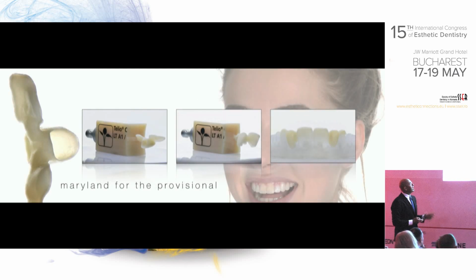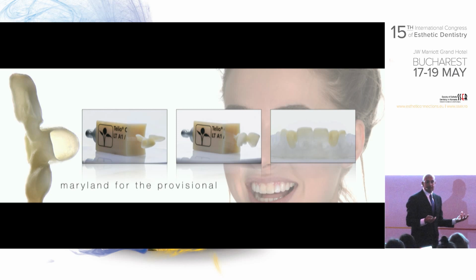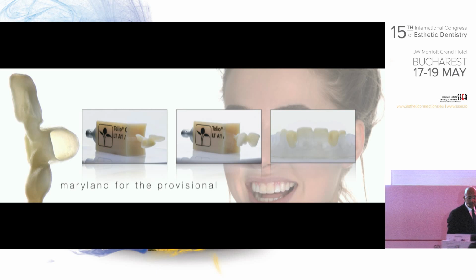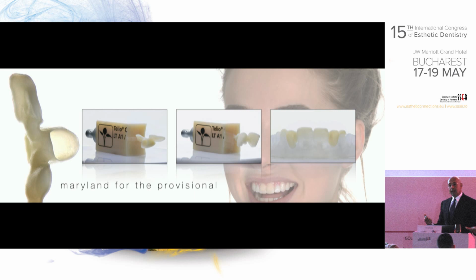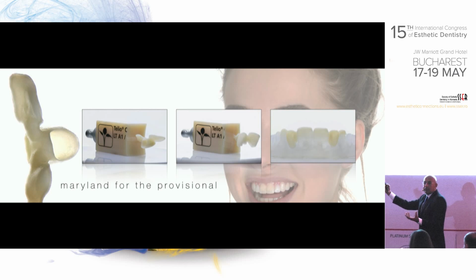So at this stage, Hilal came out with this idea of making something different, which can be worked with in two different ways. This is a provisional, sort of a Maryland bridge, but the bridge pontic here is empty. This side in here is empty, so that we can use it in two ways. If it's going to be immediately loaded, we're going to use this as a crown. If not, we'll fill this up and use it as a pontic.